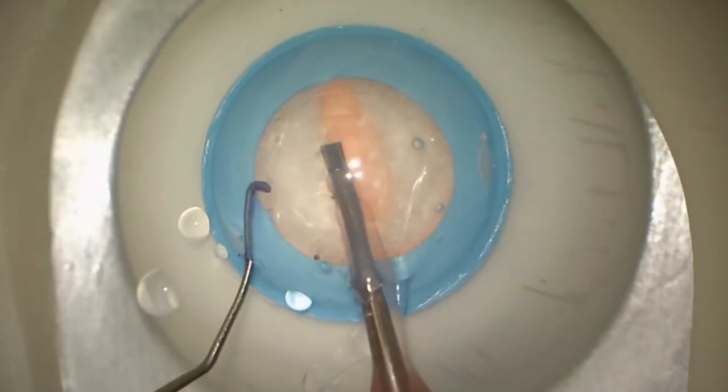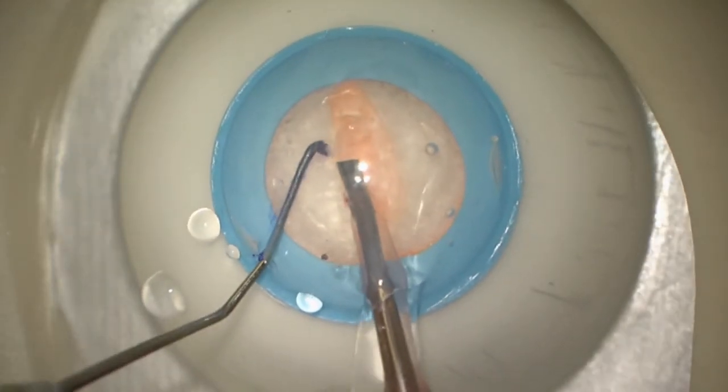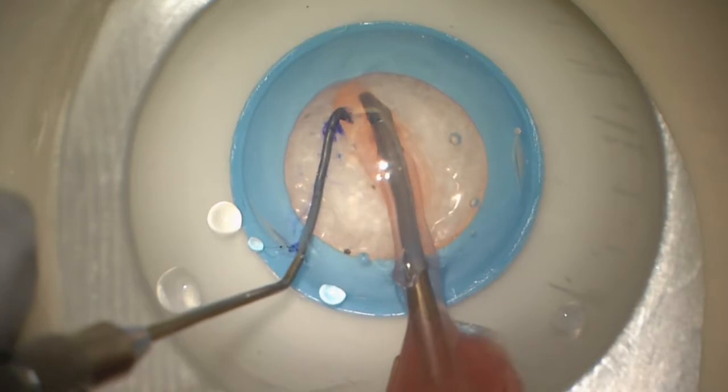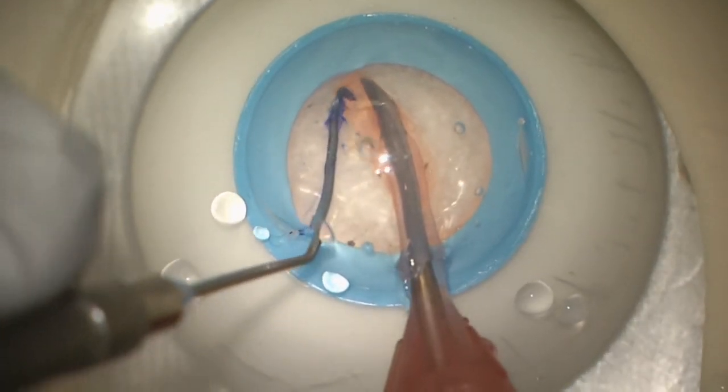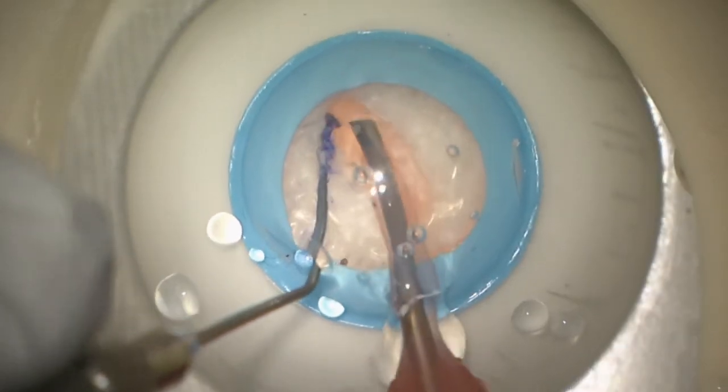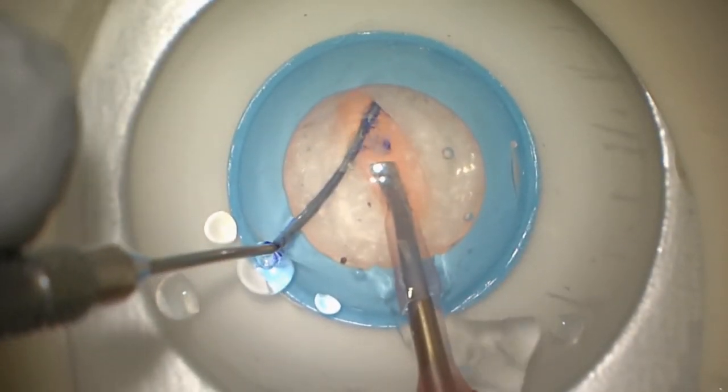One of the great things is that we can use two hands here, so we can practice the tricky part — using both hands to get the nucleus to divide into two pieces. Here you can see our resident has done a nice job dividing the nucleus into two pieces.